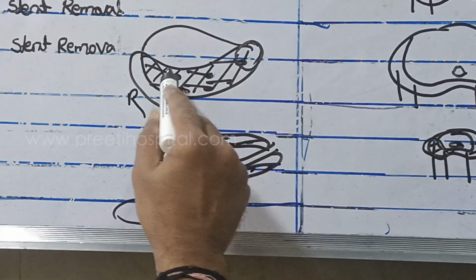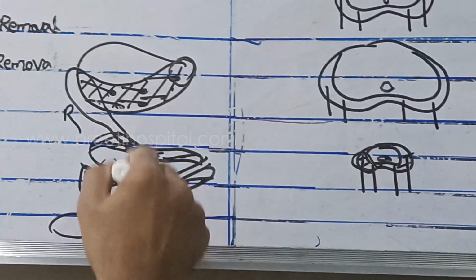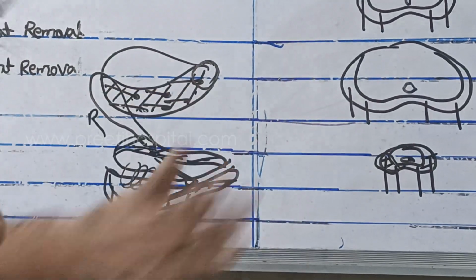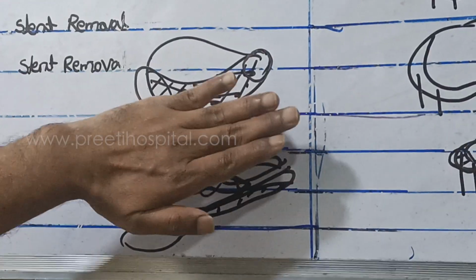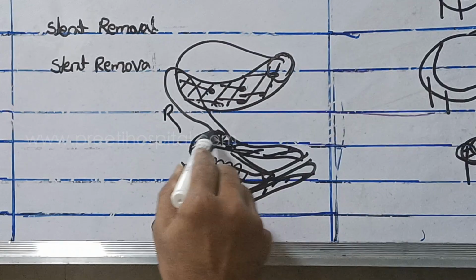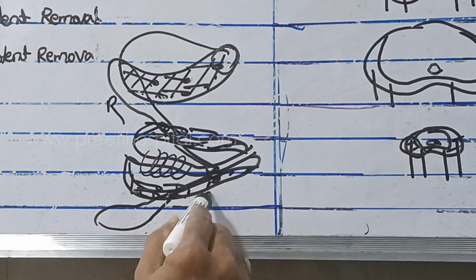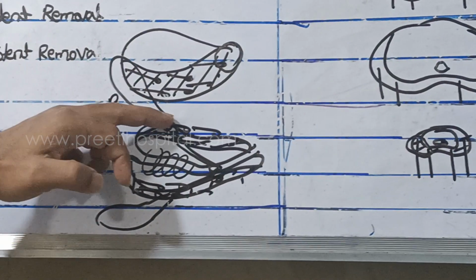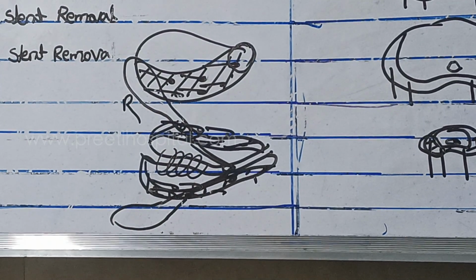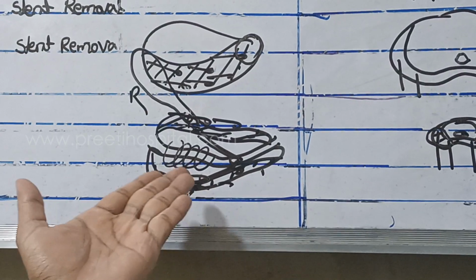1, 2, 3. Same thing here. In terms of the lateral, here it's on the right and left. Same. This is the lateral surface of only one area, either right or left. Here you are seeing both right and left. So 1, 2, 3, a little lateral, 1, 2, 3. Here medial, then lateral. Here it is anterior posterior. Here it is lateral and medial. Most of it is posterolateral. Posterior is this, lateral is this.